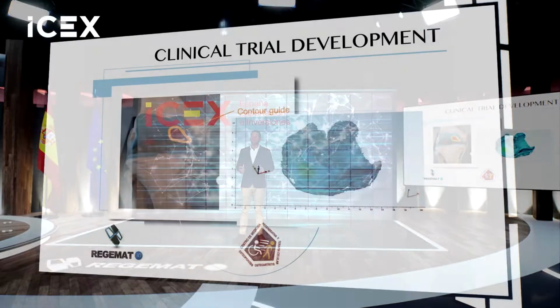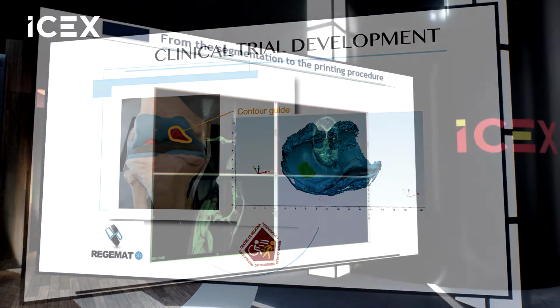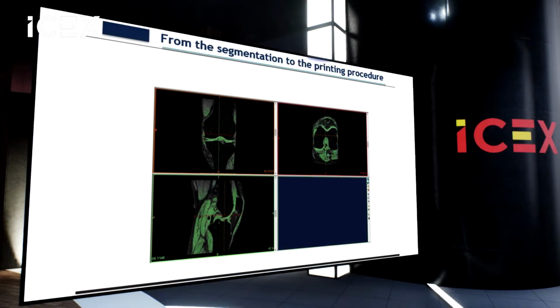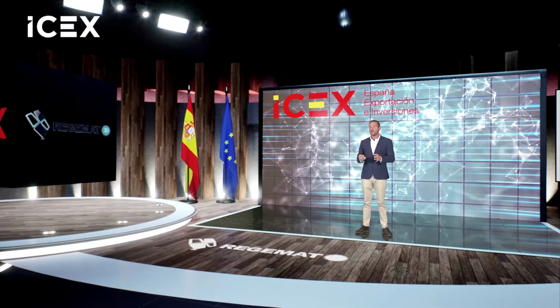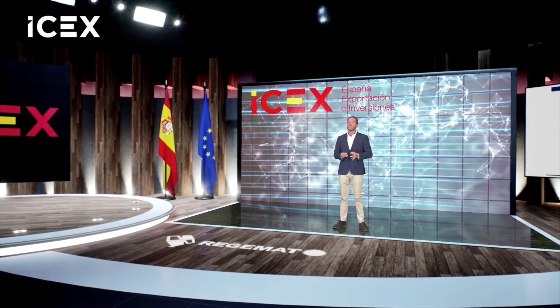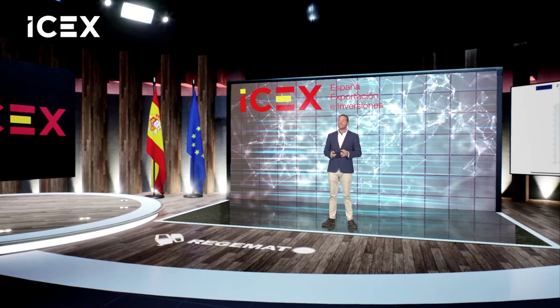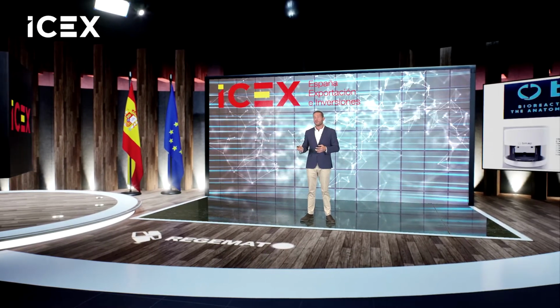We are doing our own clinical trials, and I'm going to explain how our bioprinter works. We are working with magnetic resonance, we are doing the segmentation, and after the segmentation, the bioprinter can print a scaffold with the same structure and dimension as the injury in the patient. During the same process, we are feeding the scaffold with the cells from the patient, adding proteins and so on, and we are implanting the scaffold in the knee of the patient. In less than 2 years, we are managing to regenerate the cartilage, and there is no rest of the material used for the scaffold because it's biodegradable and biocompatible.